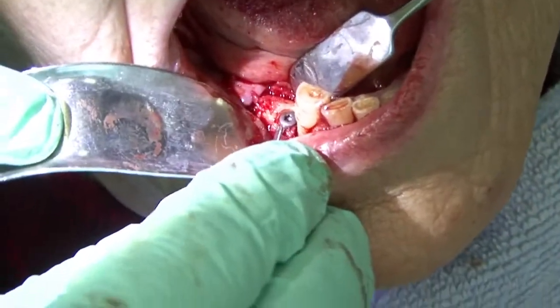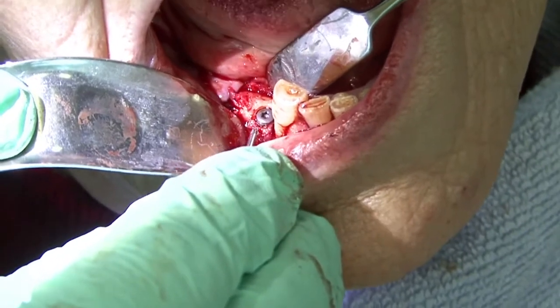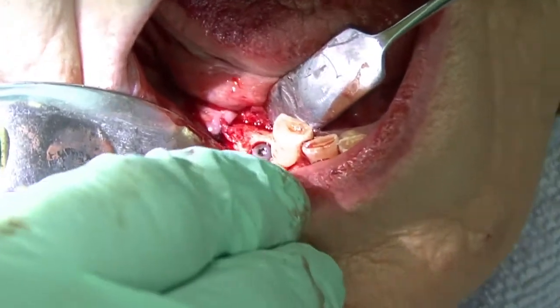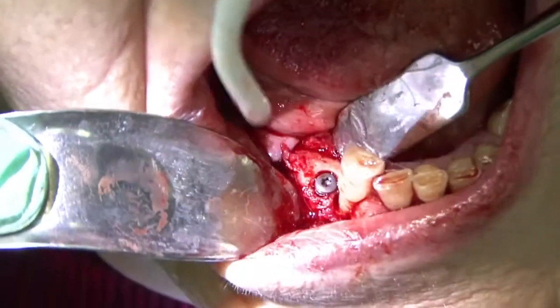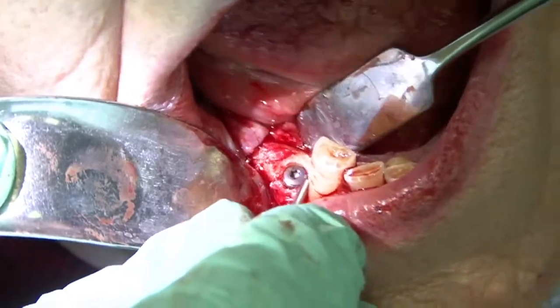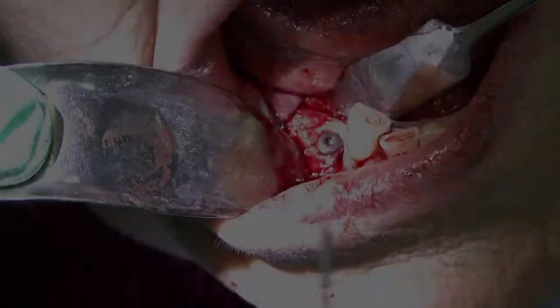Can you see the circular thread that's exposed right there? Yep. We're going to add bone in that area when we add bone here. So I'm not worried. And of course, all around the rest of it is fully embedded in bone.